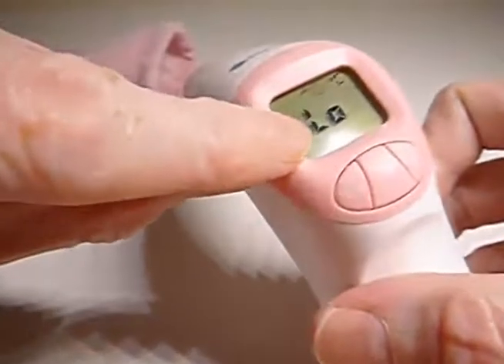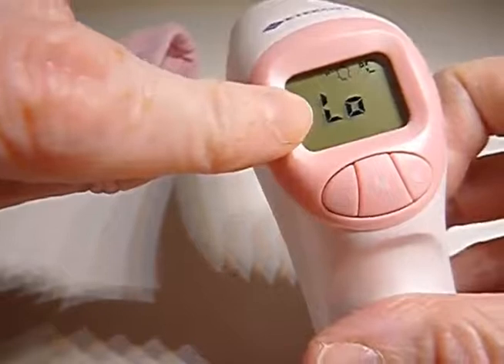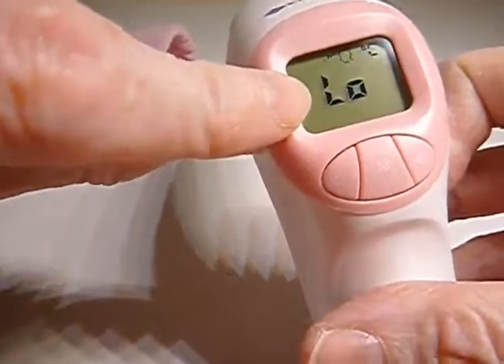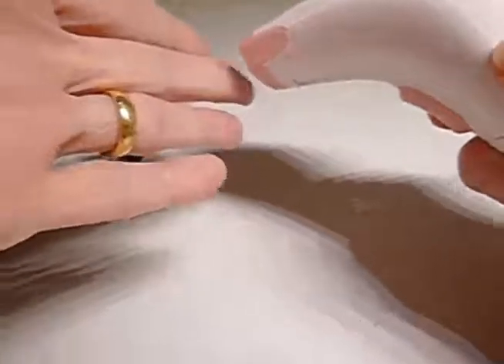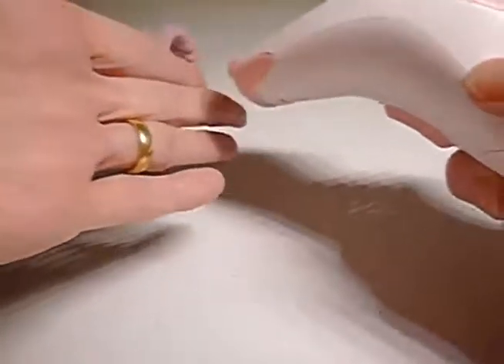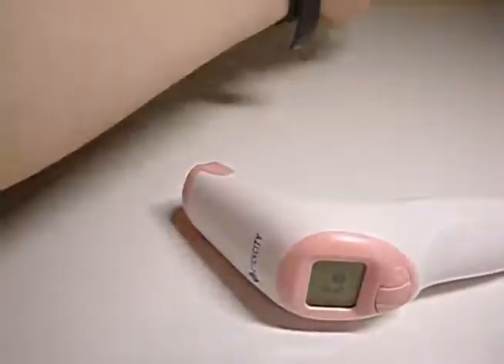It's got a nice large display panel that says low because it's not currently measuring any temperature. If it's high, if there's a fever, it will alert you to that. And the way you take a temperature is to run this about 1 to 5 centimetres away from the subject, but rather than describe it, I'll give a demonstration.